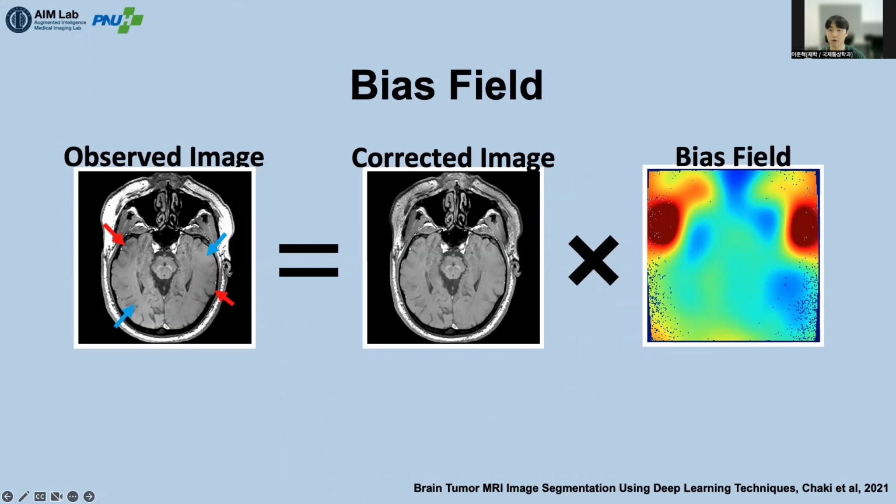Such a signal is a very smooth and low-frequency signal that can corrupt MRI images. The bias field causes intensity variation among tissues which hold the same physical property. Such distortion might bring undesirable results.